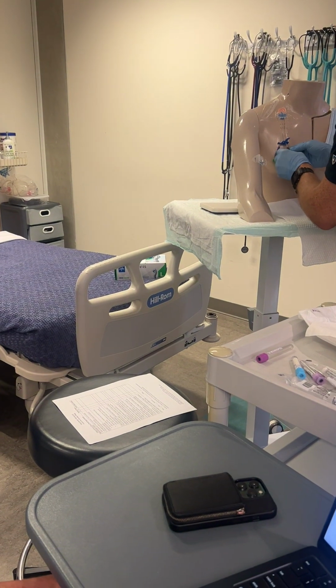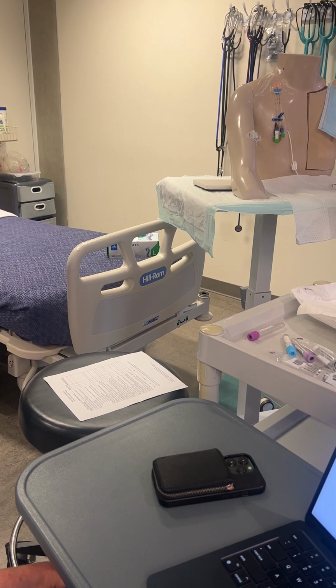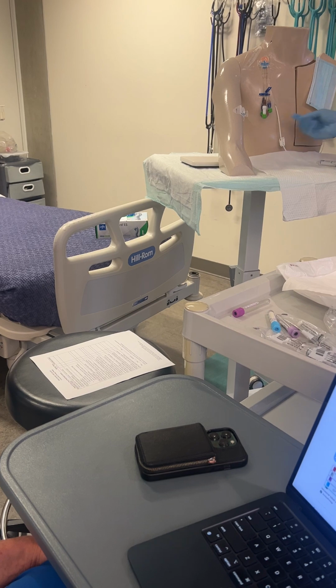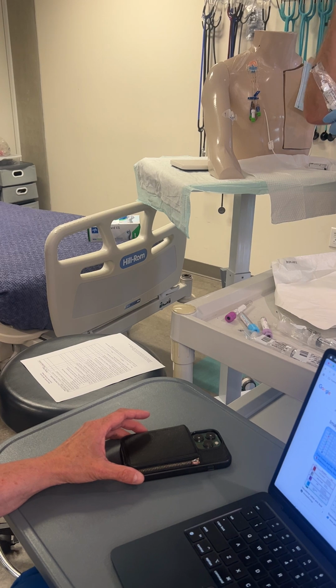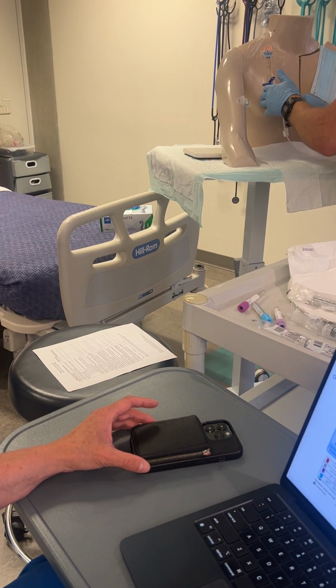Okay, so these. All right. So something's infusing, right? I got to stop it, right? So I stop it. I wait for 2 minutes. I've got to cap the IV line too. So you'll see these, just the inverse of essentially like the tip of a flush, but long and skinny, and it screws onto the end of the IV set, right? So it keeps it clean.